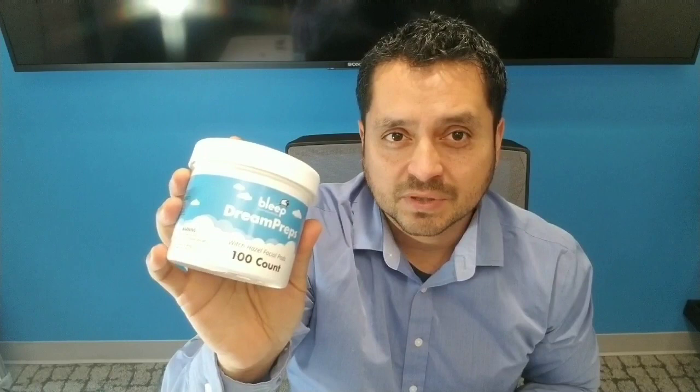Now because we are talking about adhesive, we want to make sure that the nose is very clean. You can use soap and water to wash, or if you like you can buy the Dream Preps. There's a hundred witch hazel wipes here. Just make sure you clean up very nicely and thoroughly, and make sure it's fully dry before applying the adhesive Dreamports.